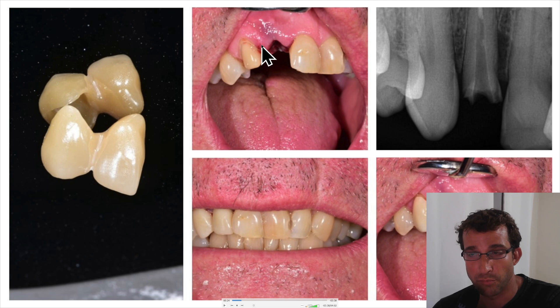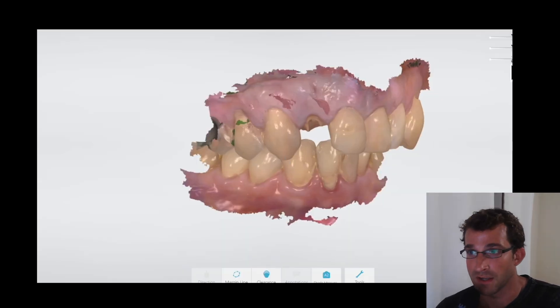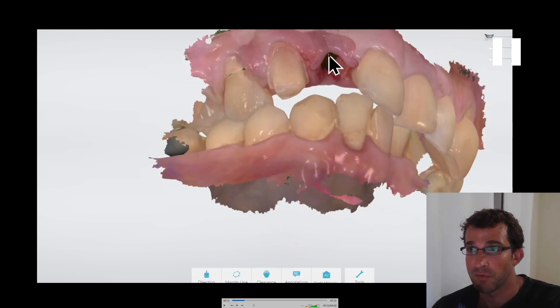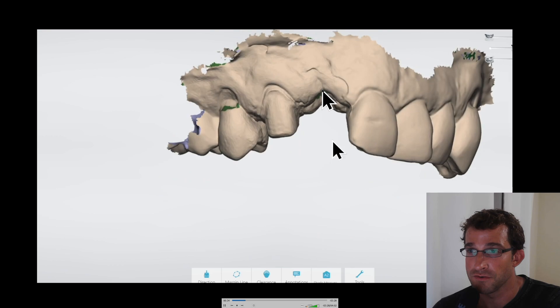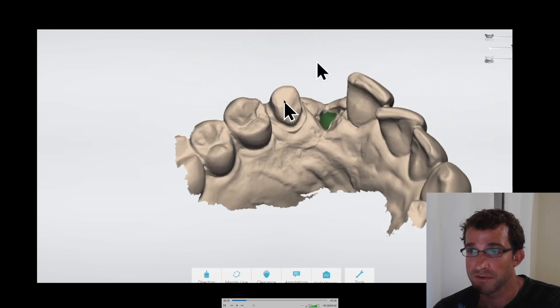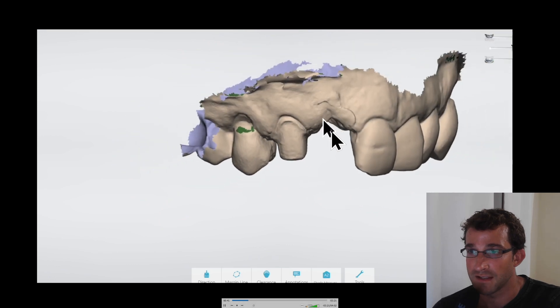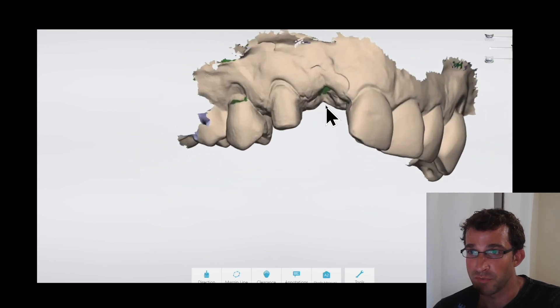I didn't record the extraction or the prep, but we did the extraction and the prep in the same appointment. So we had the patient in, froze, extracted the 1-2, prepped the 1-3, and took a scan. This was actually a next-day case, so it was ready to insert the following day — which is one of the advantages of having a milling machine in-house. Here's the scan: the 1-2 is extracted and the 1-3 was prepped, all in the same appointment. You can see the socket as scanned immediately post-operatively.